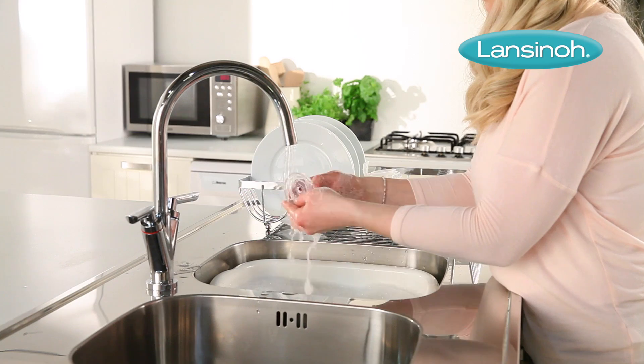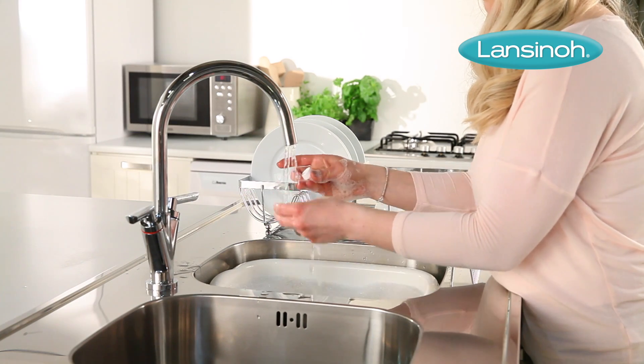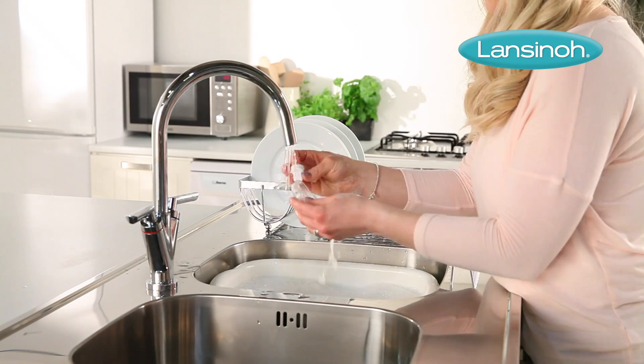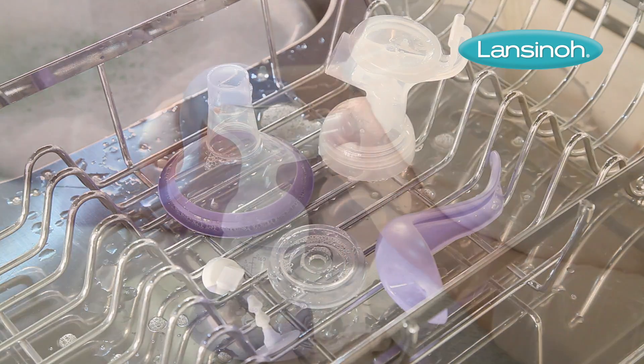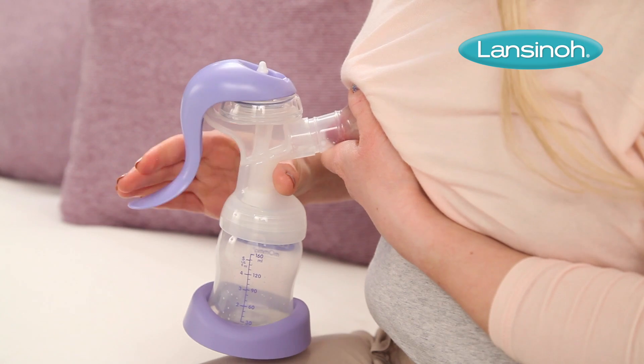The white valve, silicone diaphragm and stem, as well as the breast cushion, should all be hand washed. Make sure you completely air dry all parts before assembling the pump and using it.